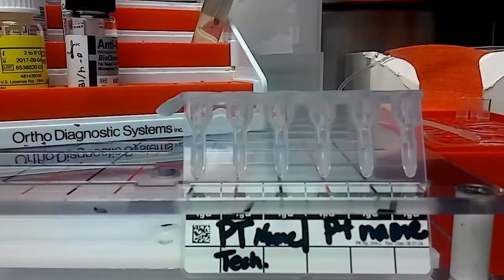Hey guys, it's Mara. Today I wanted to show you how to do an antibody screen on a patient. I'm going to be using QC materials instead of patient plasma or serum, but just so you can get the idea.